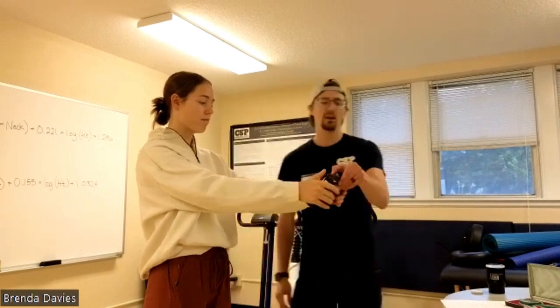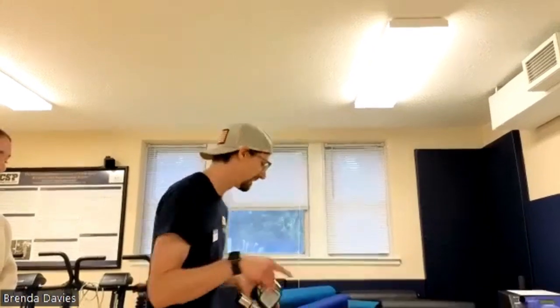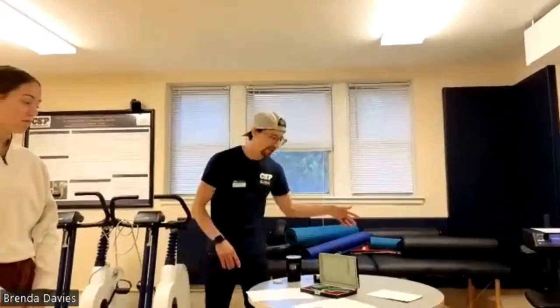Okay. And so this one is for an athlete. We're at 16.9 for that body fat percentage. So if you're a non-athlete compared to an athlete, it's assuming the water is placed in a different spot. One is assuming that there's more interstitial fluid, the other that there's more water in the muscle. So again, 0.3% difference between the two for Anna, but a 6 or 3% difference between body composition between bod pod and BIA at the moment. Okay. Any questions on this?